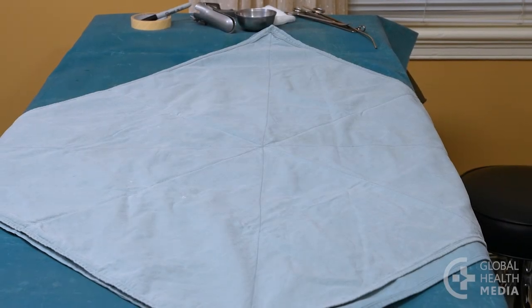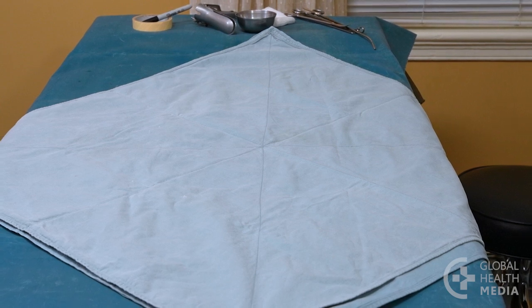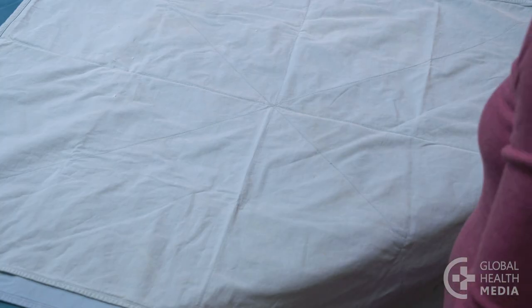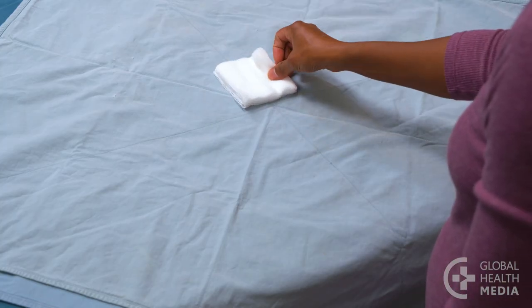First, lay down two layers of linen or paper on the table to form a diamond shape. Place your pieces of gauze in the middle of the pack.